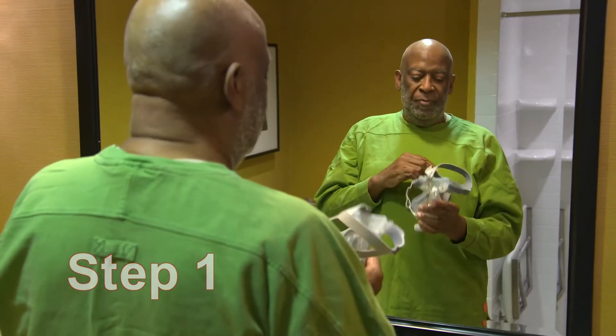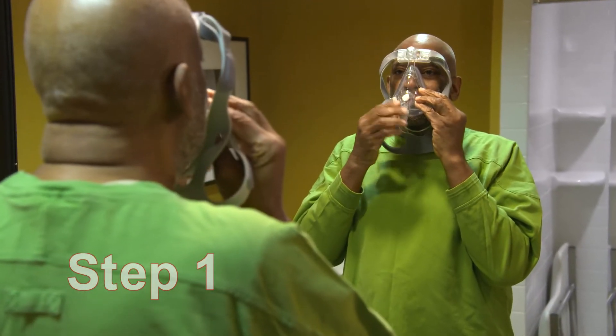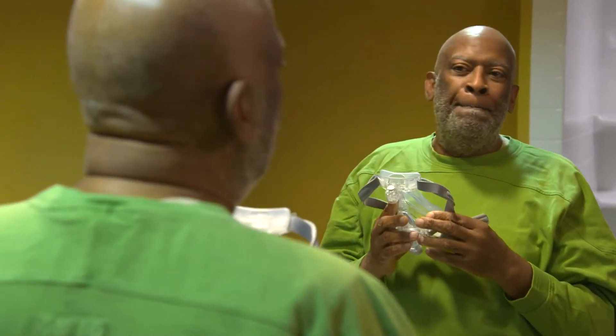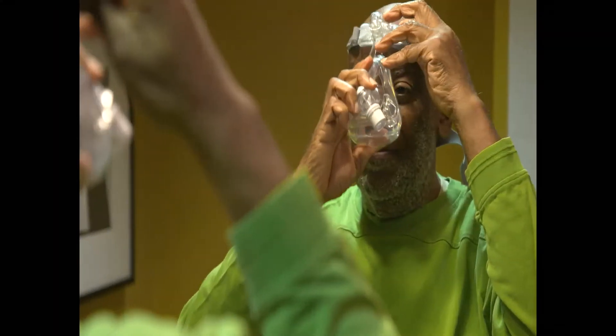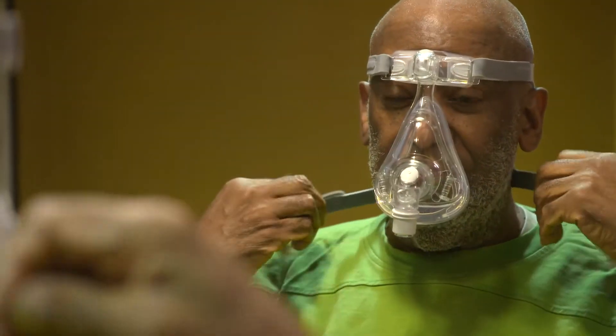Step 1. Let's get started. Our goal is to first get comfortable using your PAP while awake. Start by just momentarily holding the mask to your face a few times, without actually attaching the straps yet. Then practice putting the mask on and off several times using the straps.